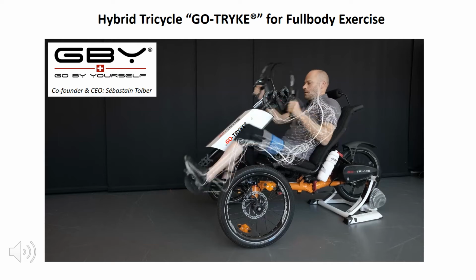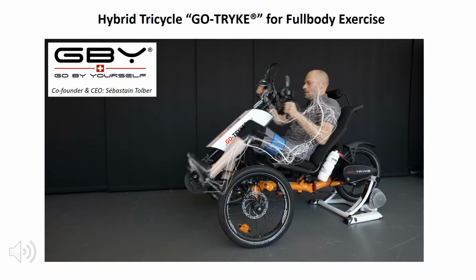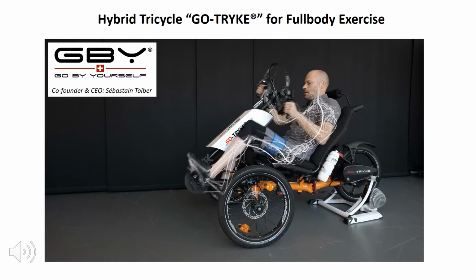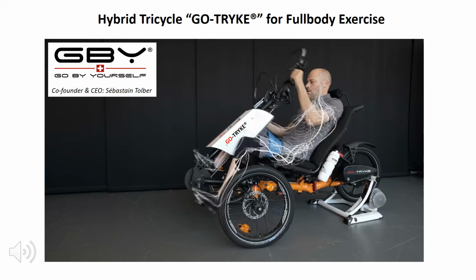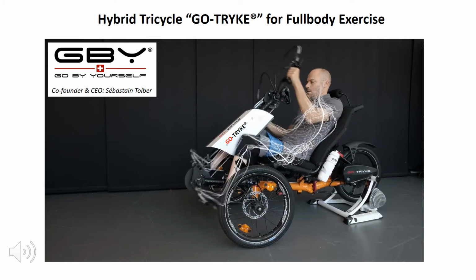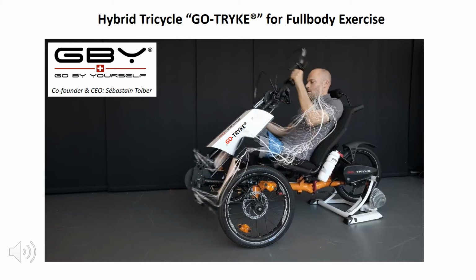What's interesting here is that there's arm and leg movement, and that the arm and leg movement are synchronized in such a way that you would mimic walking. That is, the arm swings in the same way that it would move when you're walking or during a stroll or whatever.